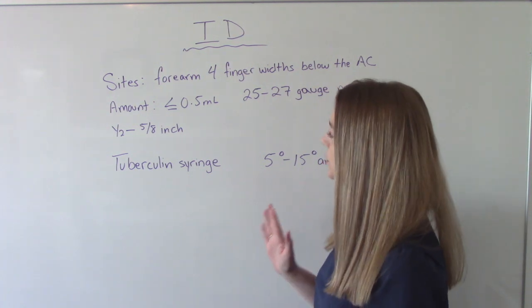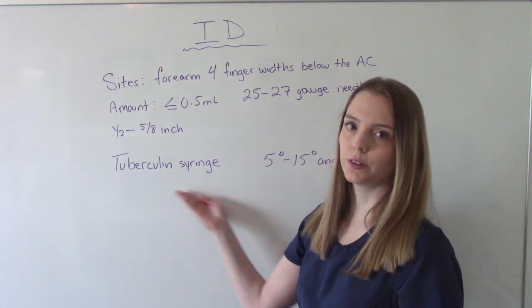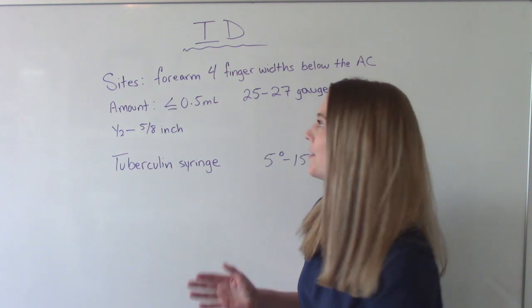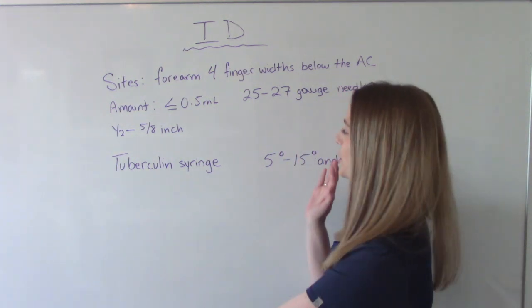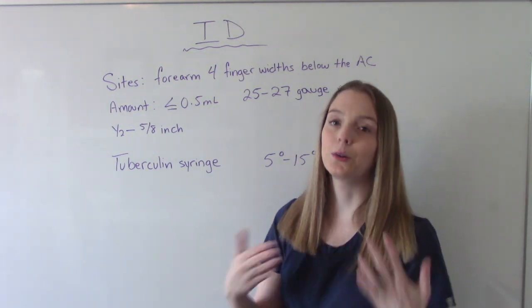And the syringe we use is usually called a tuberculin syringe because nine times out of ten, the reason you're doing an intradermal is because you're doing a tuberculosis test.